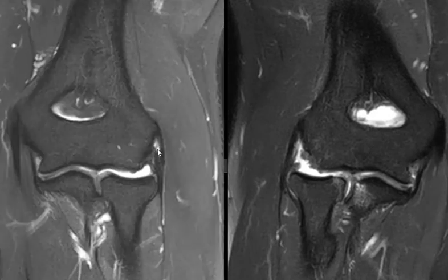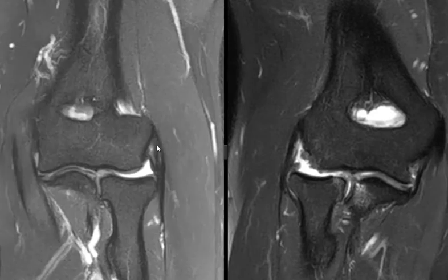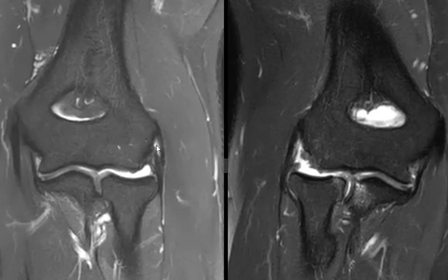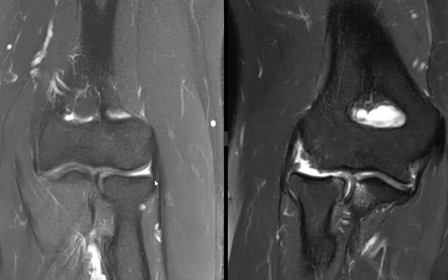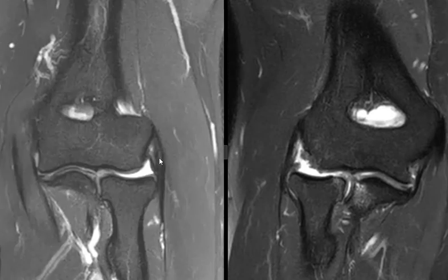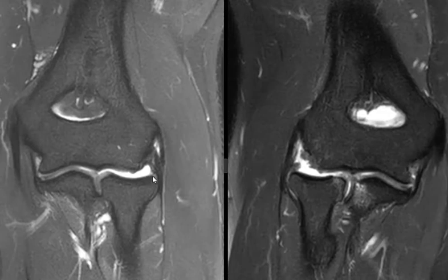In this patient, there is bright signal in the common extensor tendon — a little longitudinal intersubstance tear and some tendinopathy — and so we can see these deeper ligament structures separated. This is the radial collateral ligament here, coming off the edge of the radius, going up and attaching to the humerus.